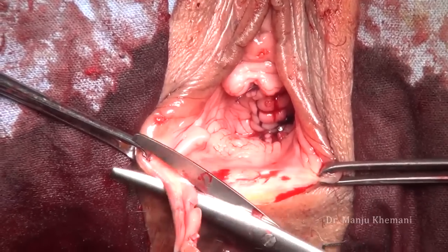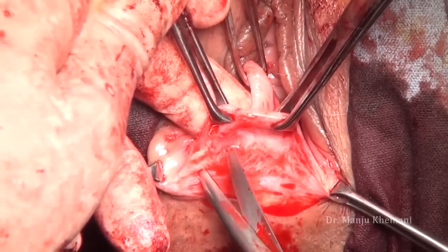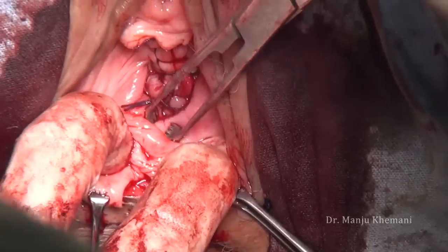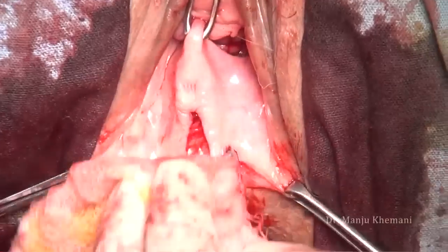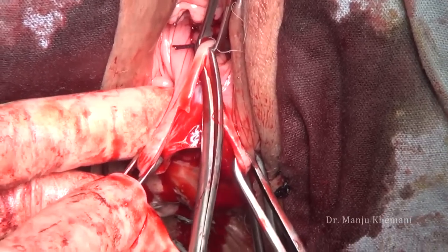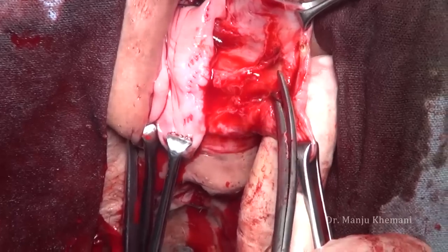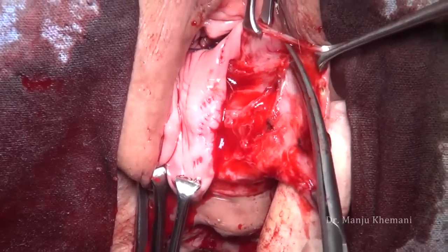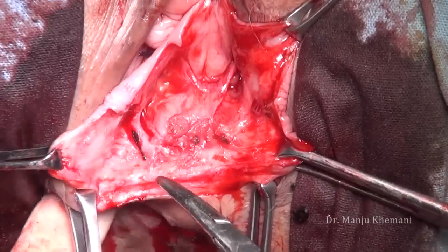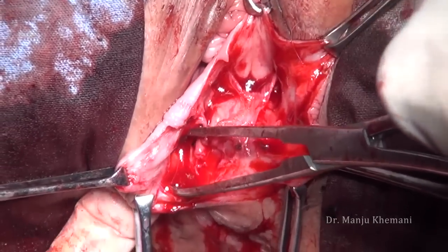The dissection is done between the rectum and the vagina — you have to identify the correct plane by sharp dissection. I again don't use any vasopressin or saline. The upper extent will be until you meet the transverse part. Once you have cut the vagina, by sharp dissection separate the vagina from the rectum. The same thing is done on the opposite side.